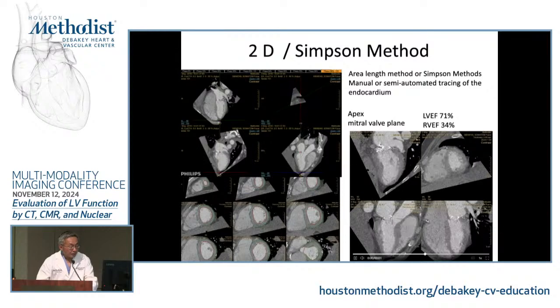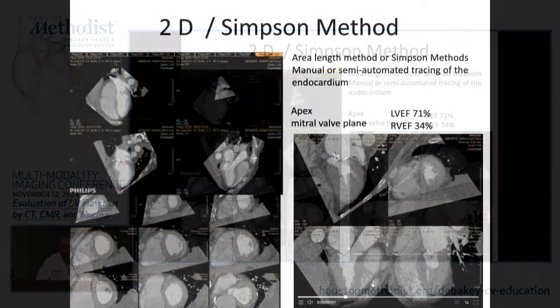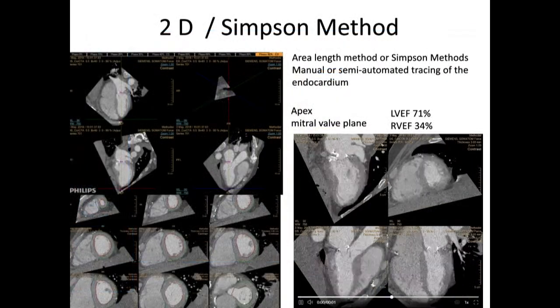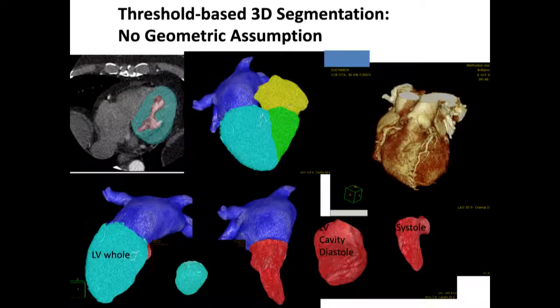And traditionally, there are two ways of measuring it, okay? The hard way, like what they do in MRI, manually tracing, by fellows' hands, although you guys have better automatic segmentation algorithms right now. So it used to be quite painful for the fellow, spending your MRI rotation tracing it. Or 3D, okay?